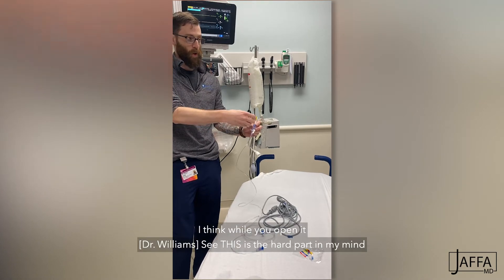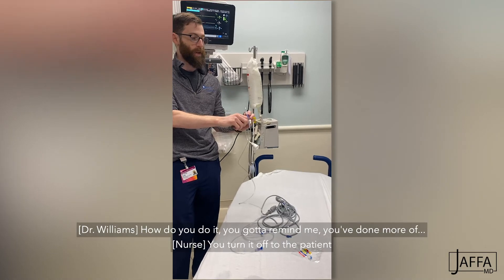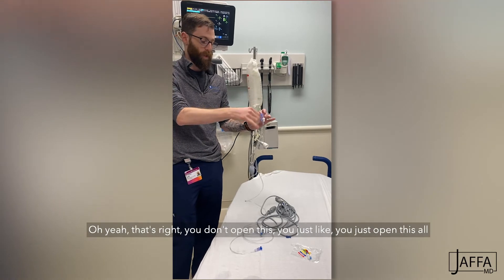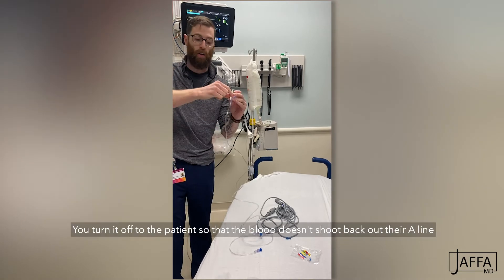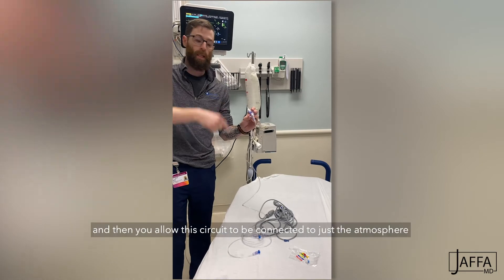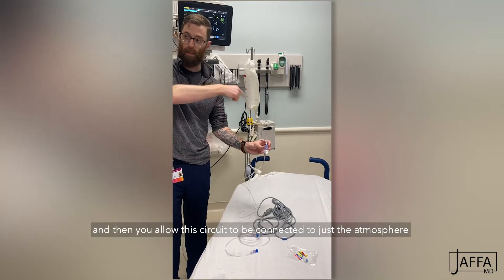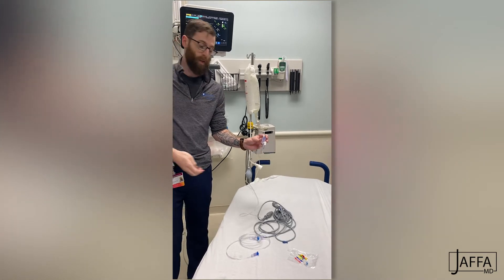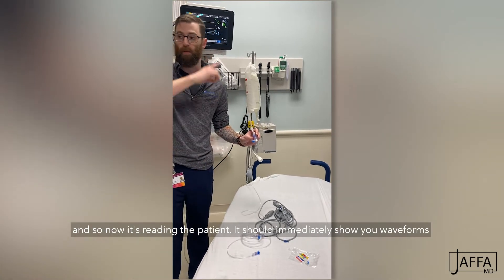You turn it off to the patient so that the blood doesn't shoot back out their A-line and up into the system. Then you allow this circuit to be connected to just the atmosphere, and that grabs the zero pressure from the atmosphere at the level of the heart. Then you close this off, turn this back, and now it's connected to the patient and reading the patient.